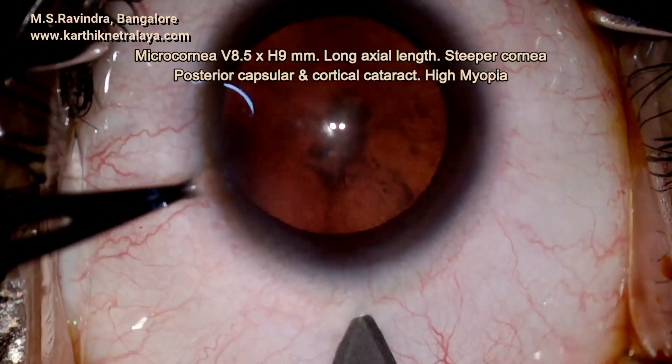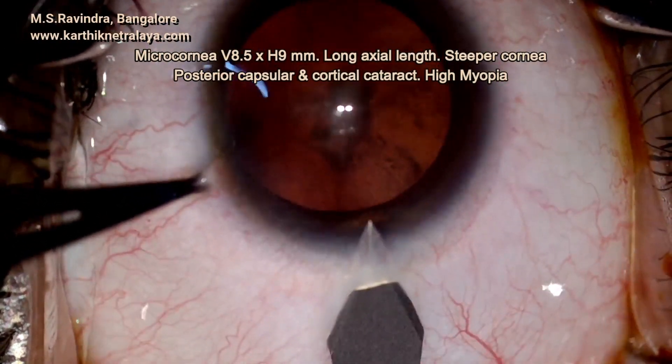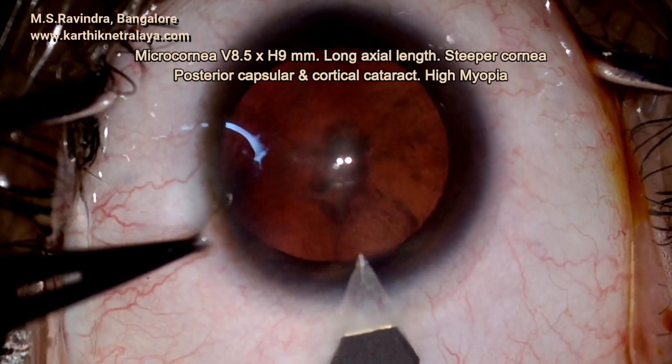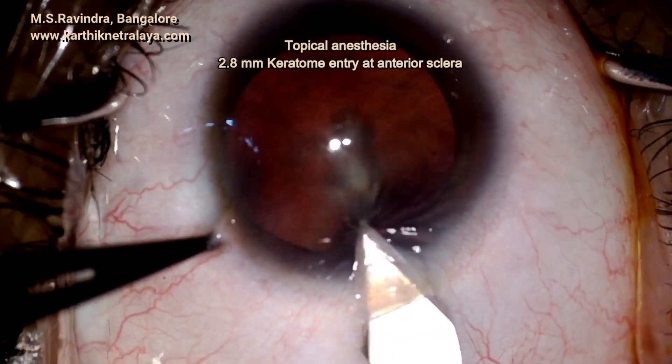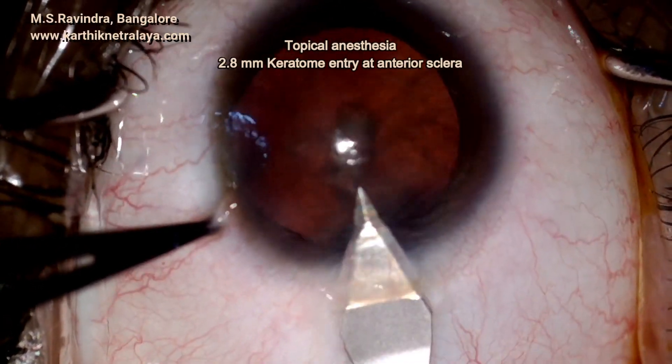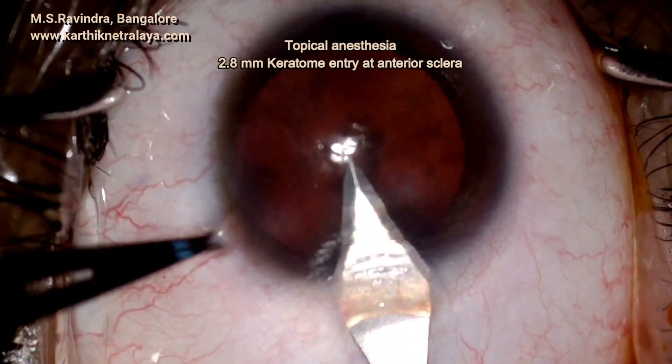A middle-aged lady presented with bilateral cataracts. She had microcornea. The cataracts were cortical and posterior capsular and subcapsular in area.